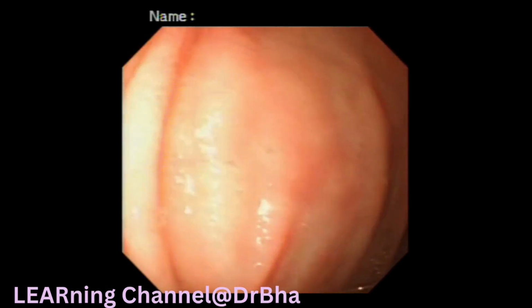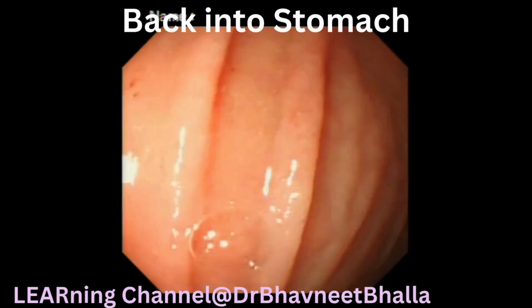After examining the second part of duodenum, withdraw the scope gently to go back to the stomach, and position the scope in front of the pylorus.